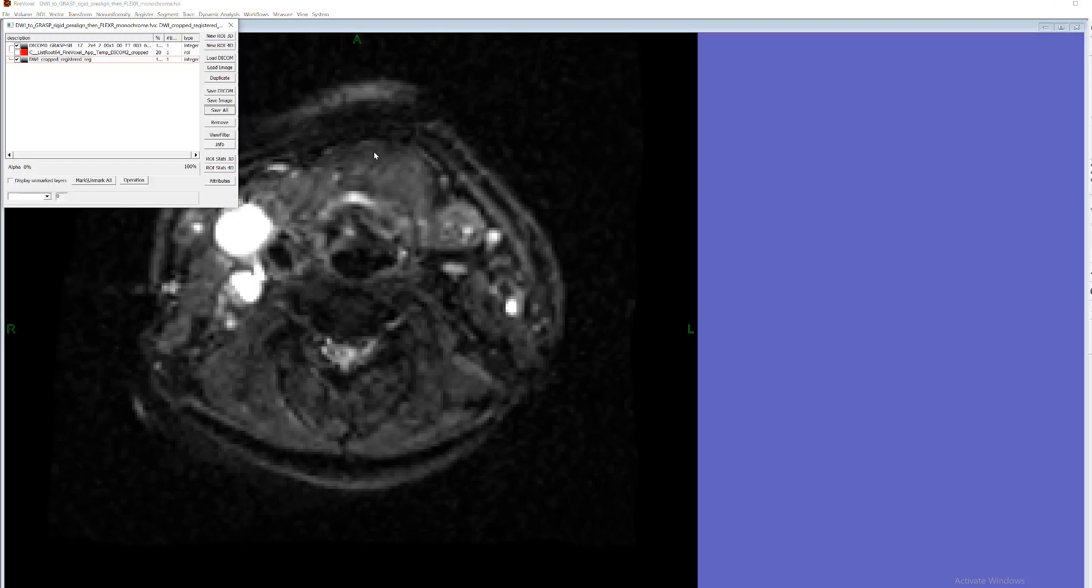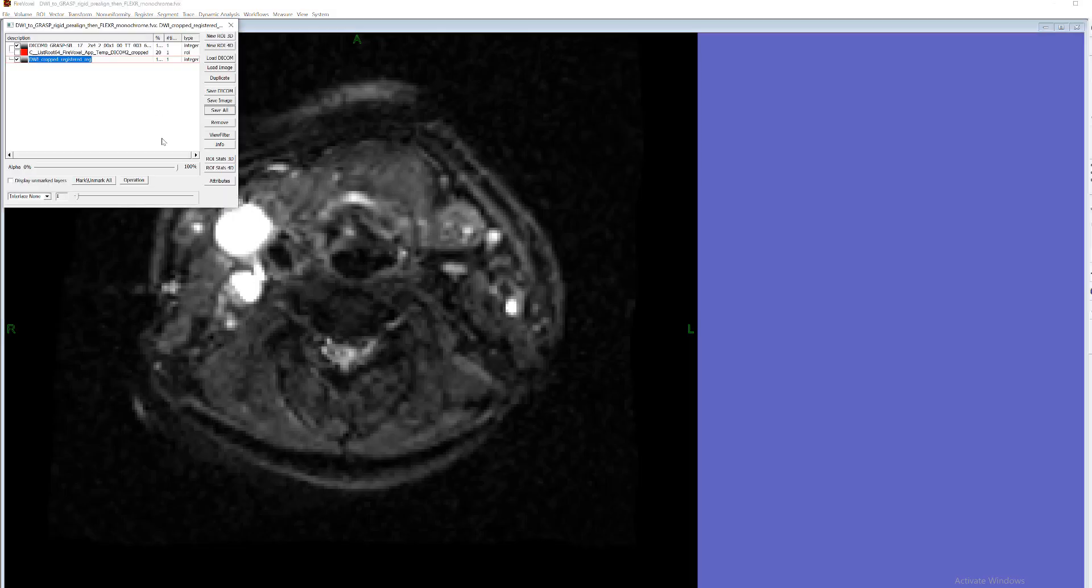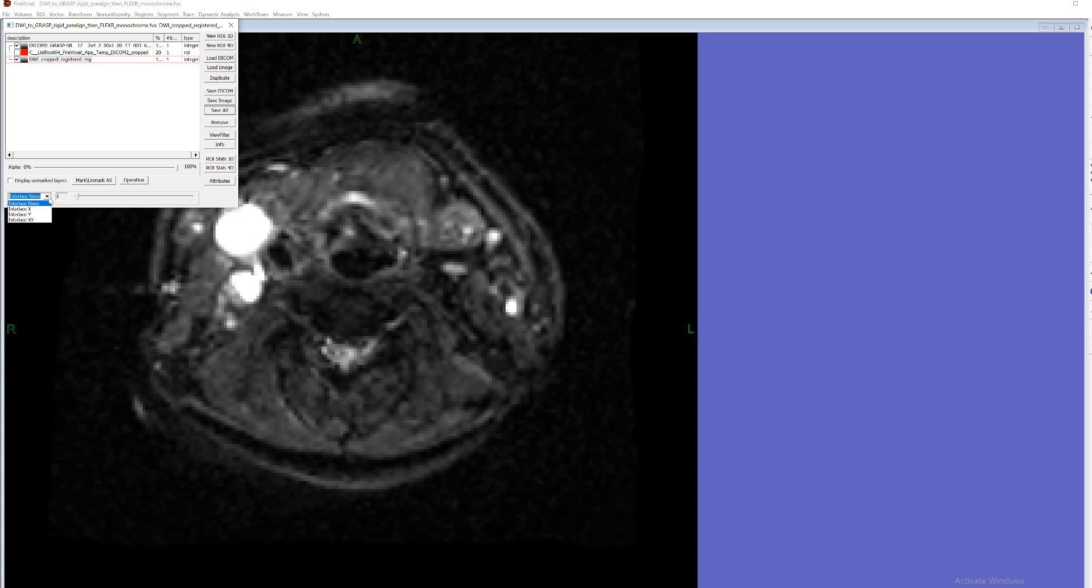However there might be sometimes more convenient to use this new interlacing feature. So interlacing feature works for the entire document. And there are three types or four types of interlacing. None is just the default view.